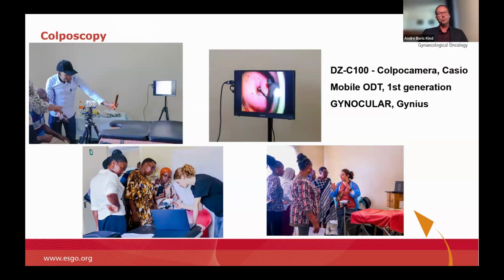We use digital colposcopes, and the advantage is that it's really a brilliant picture with very good lighting. And the big advantage is, again, that you can mirror the exam live on screens so that not all the course participants have to gather between the legs of women, but can stand on the side and follow the exam together with the woman if she wants to.